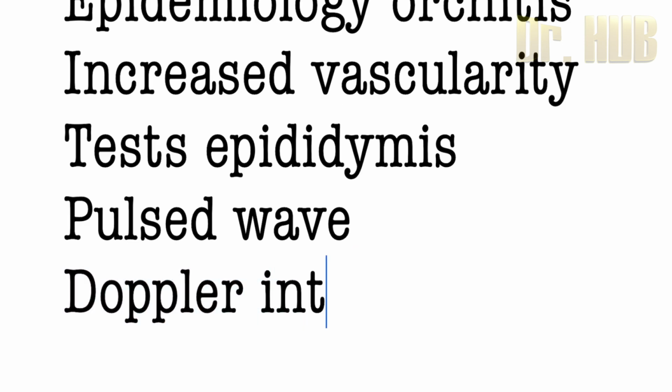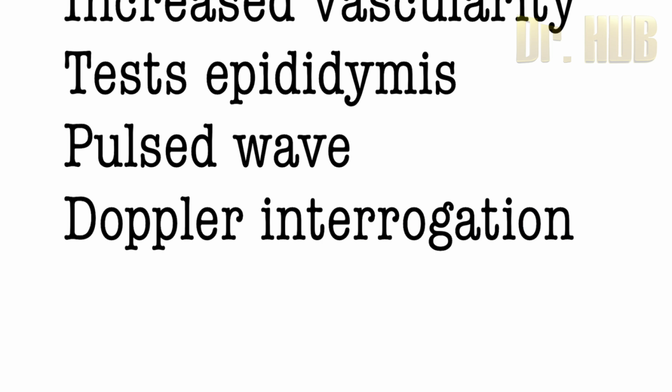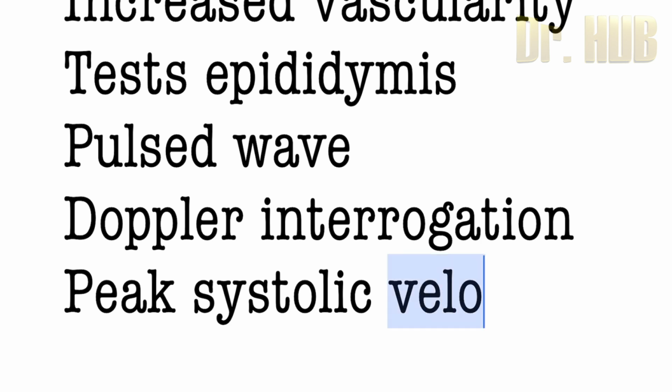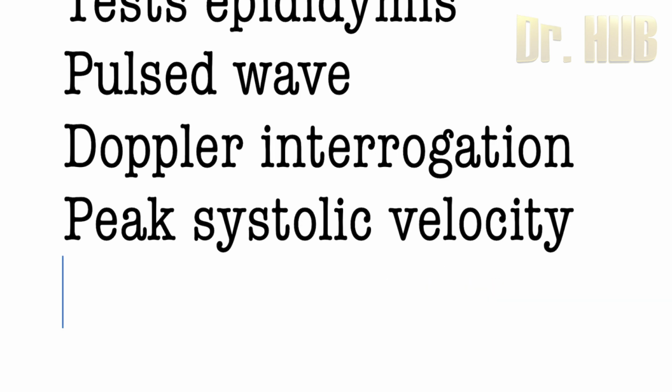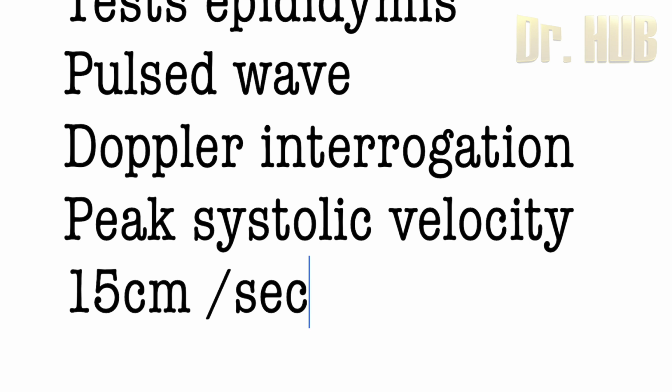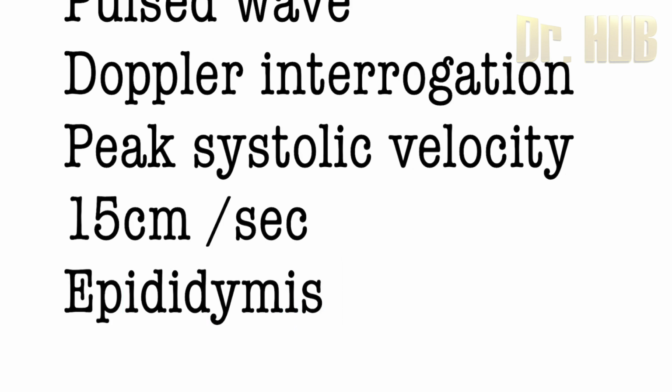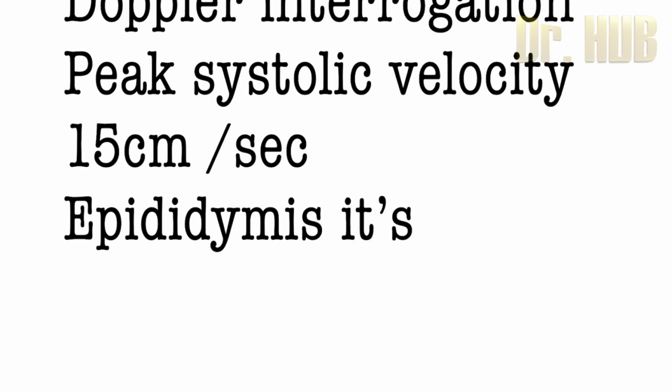Doppler interrogation yielding an epididymal peak systolic velocity greater than 15 centimeters per second. It is highly suggestive of epididymitis.